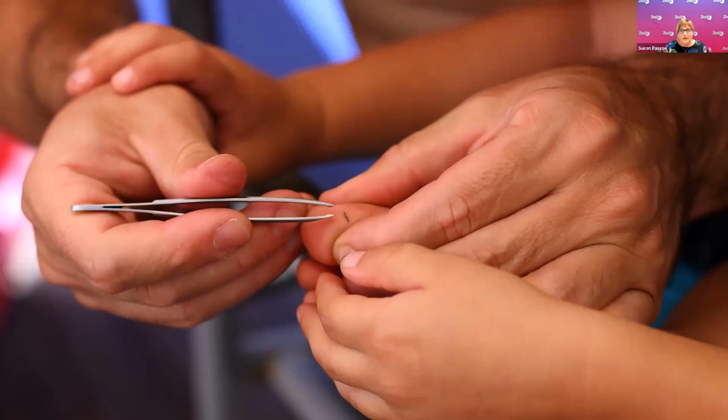Most soft tissue foreign bodies are involuntary, resulting from accidental injury, but special consideration is also necessary for those psychiatric patients who may purposefully insert foreign bodies into soft tissue. Metals, splinters from wood, and glass foreign bodies are the most common, and they're most commonly found in the hand, the wrist, or the finger.